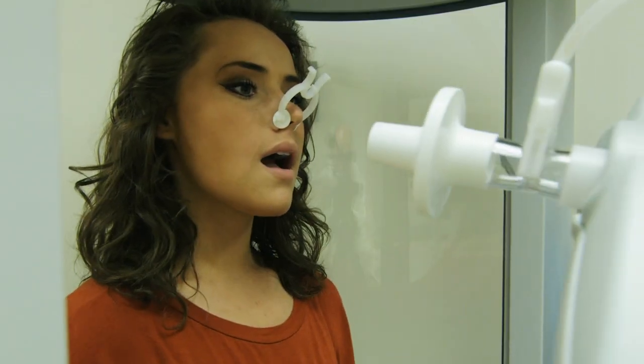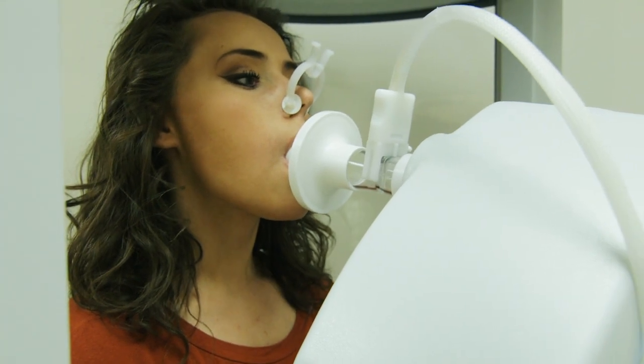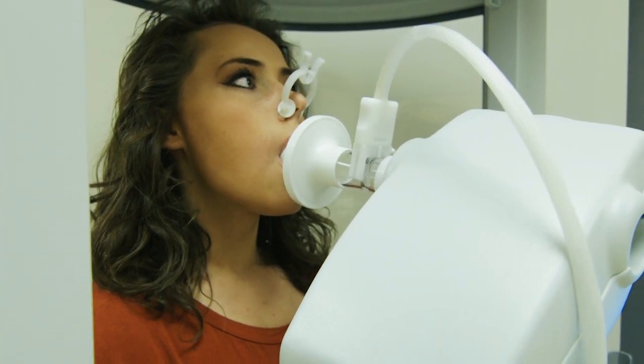Now put your lips and teeth around the filter. Make sure that you have a good seal. Take a couple relaxed breaths in and out.